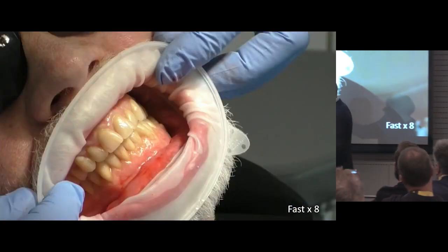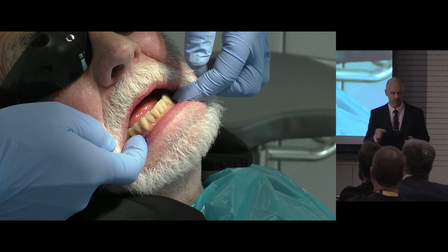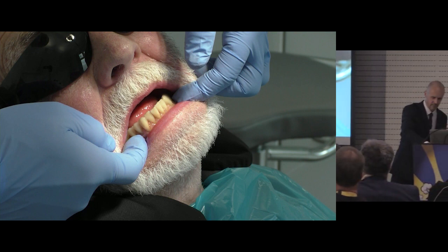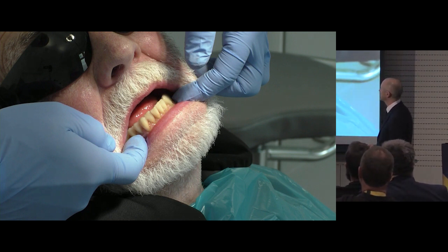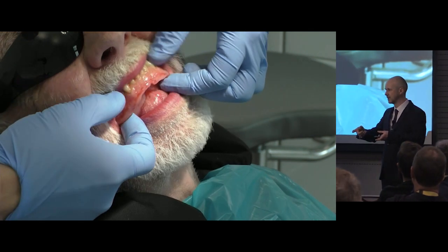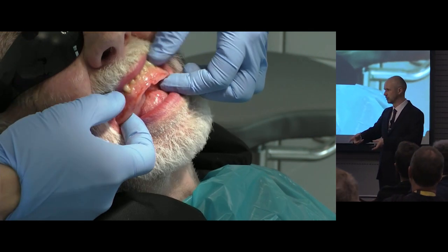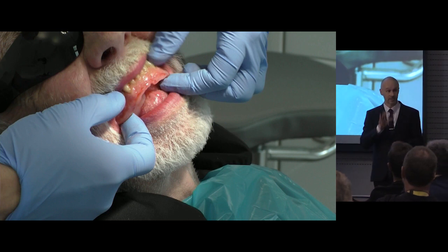And when I take the Optiguard off, this is the level of suction that I had with this, and I hope the sound's on because it's really important. So I'm just going to take it out, and there's no implants on that, and that was the suction that I got with this complete lower. And I want to show you how I did that.